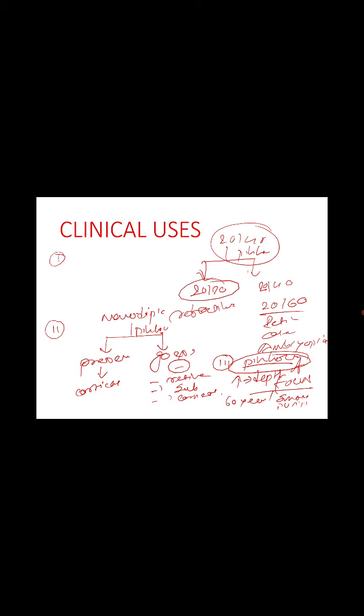But try to understand the first clinical orientation, which every clinician knows, and it's simple, that it differentiates refractive error from maybe retinal disease or ophthalmic pathology or amblyopia. And the second important use of pinhole is to differentiate monocular diplopia. And the third important clinical correlation with pinhole is when you put the pinhole, it increases the depth of focus.